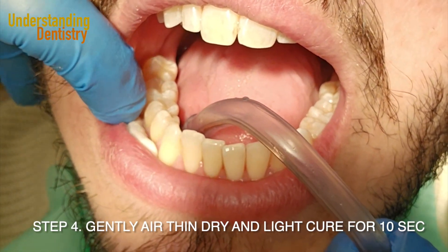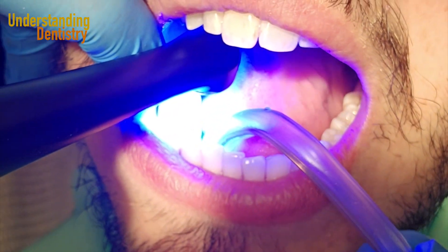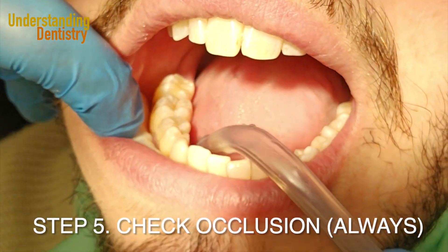After brushing the material on the surface of the restoration and the adjacent enamel, we are going to thin, dry, and light cure this material. Here we are using the Valo X, a very nice light curing device from Ultradent.